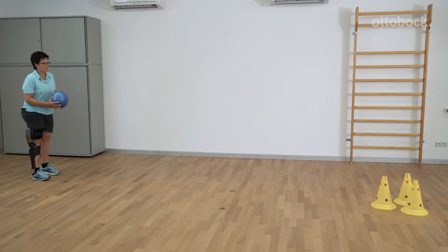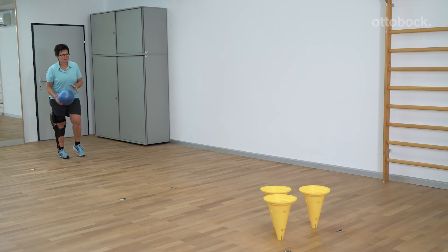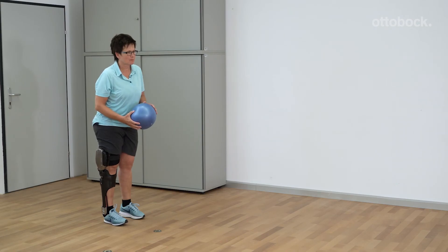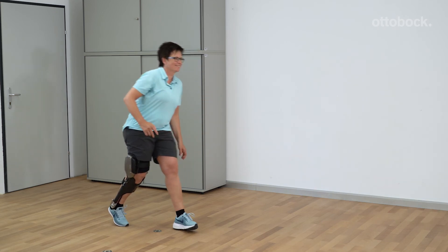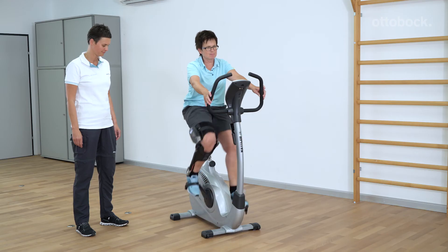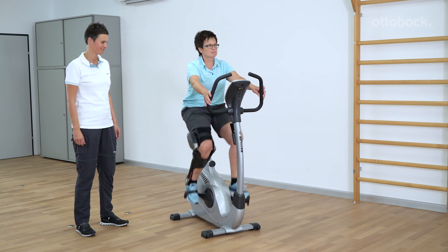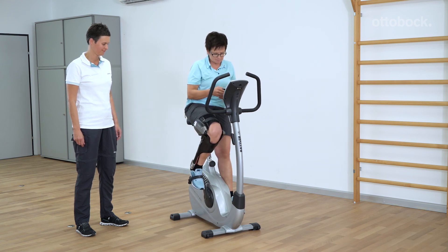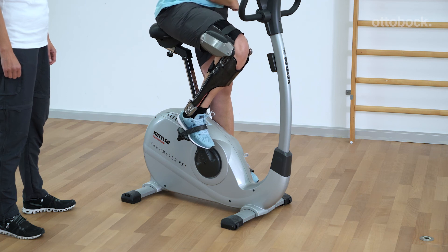A user-defined mode for activities such as bowling or cycling can be configured by the O&P professional in the Setup app. Patients can make minor adjustments to these settings in the Cockpit app. For bowling, for example, the parameters were set so that the flexion resistance increases steadily with flexion and the orthotic joint is locked at a certain knee flexion angle. Both resistance parameters were set to zero for cycling. Switching back to Basic mode immediately after dismounting is particularly important with these settings.